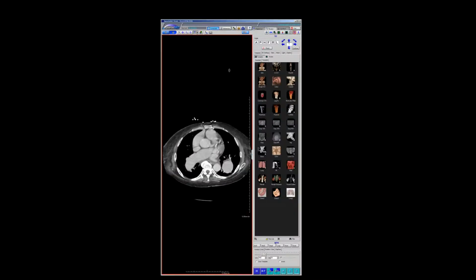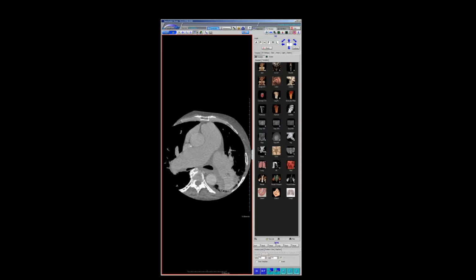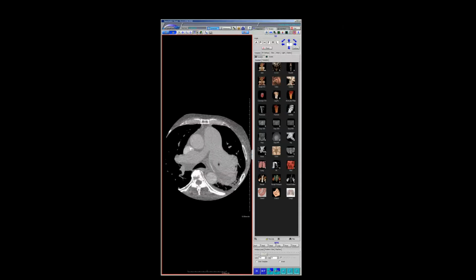so if you look at the study that was done a week before, this patient had findings of massive pulmonary hypertension, but a week before actually had no in situ thrombus. I always figured that in situ thrombus was a very slow chronic process. Here's our delayed imaging on our study, where you can see the interval development of this in situ thrombus. Just within a week, you can even see some contrast imbibing between the in situ thrombus and the wall.